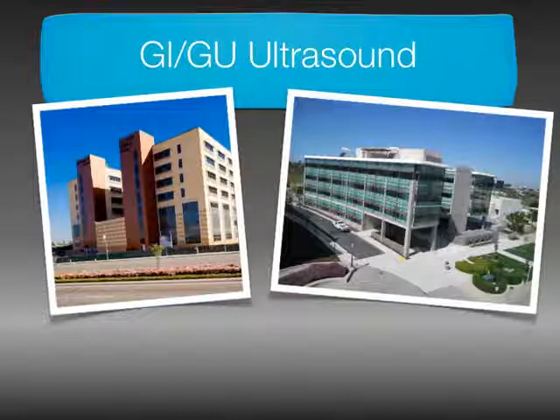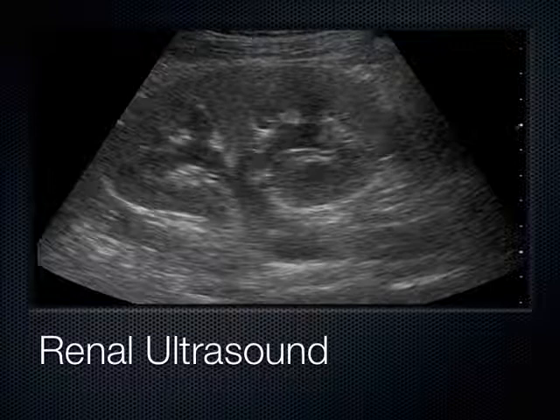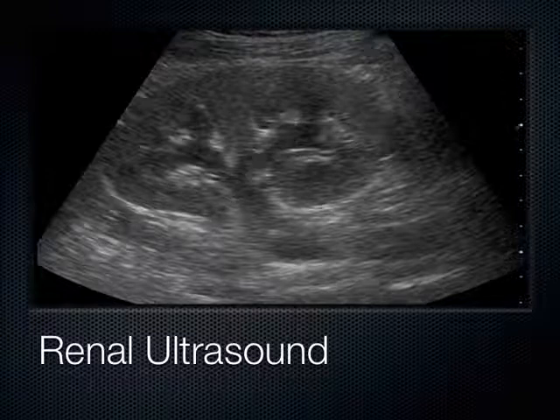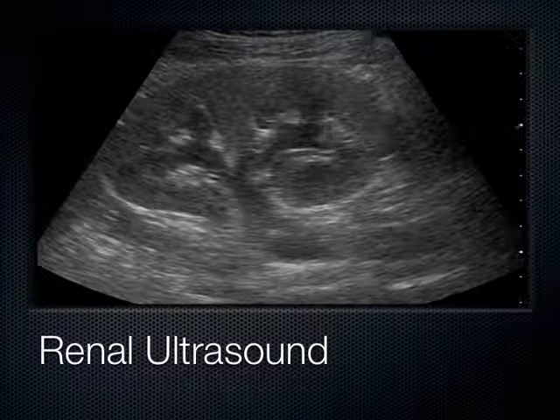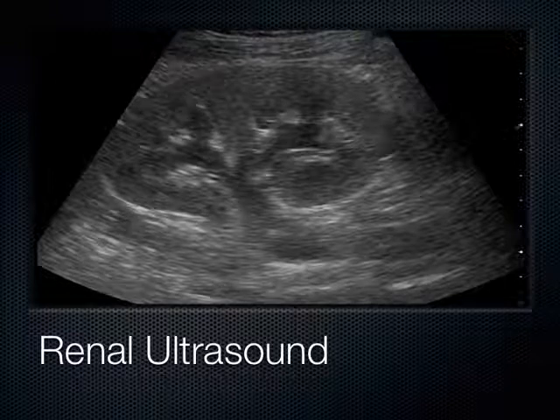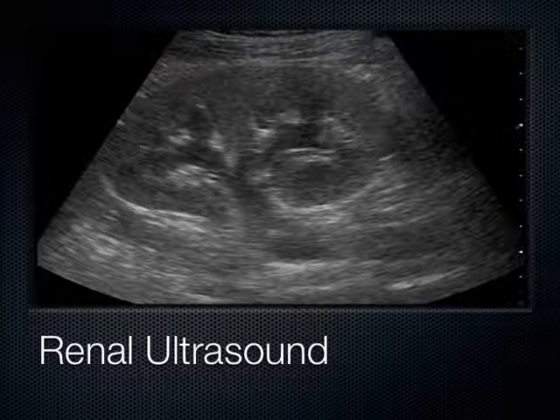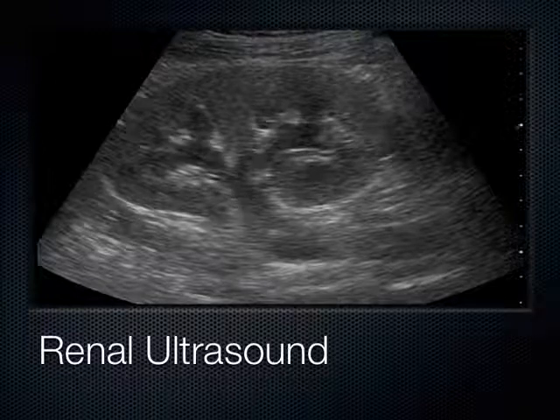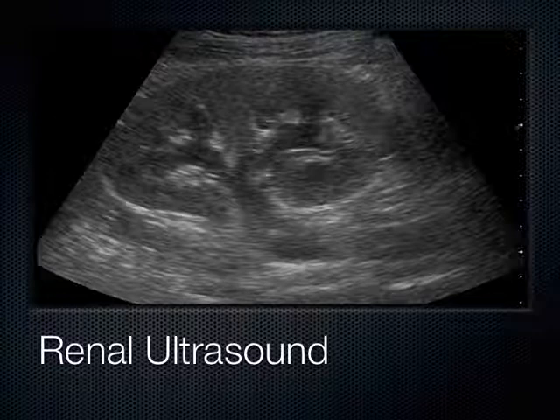We're going to quickly transition into the kidney, some intestinal structures, and the gallbladder. This is the kidney — you can see it here. The capsule is a very rigid structure, and when the kidney expands it has nowhere to go. So it causes the patient a lot of pain if the kidney gets obstructed, for example when a kidney stone blocks the ureter, causing terrible colicky pain.